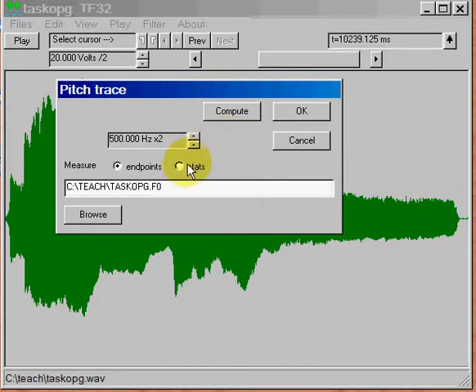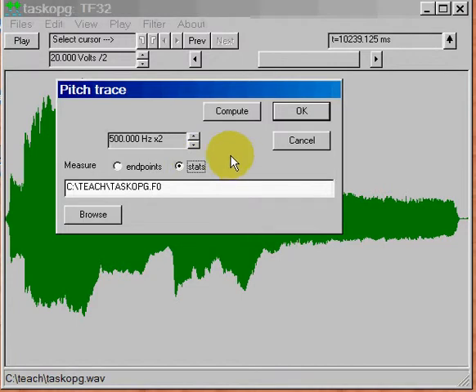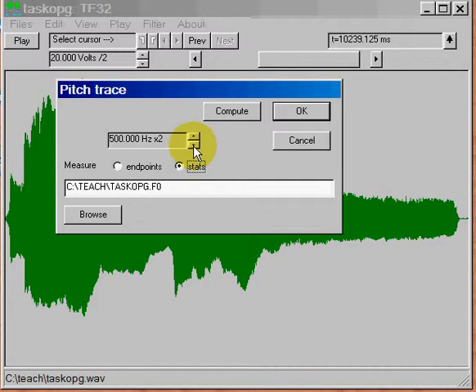I want you to select the stats option. And then I also want you to, you can play around with the frequency range. And since this is a maximal effort test, the fundamental frequency of my voice might be quite high.